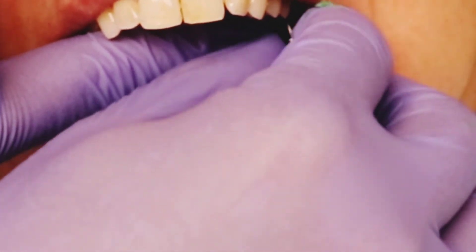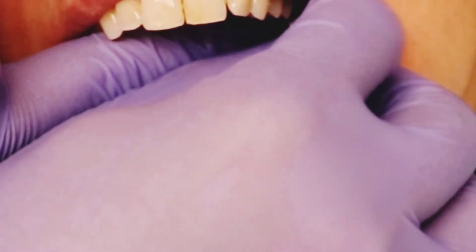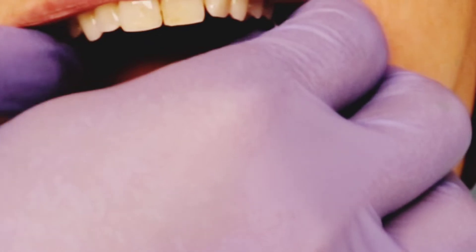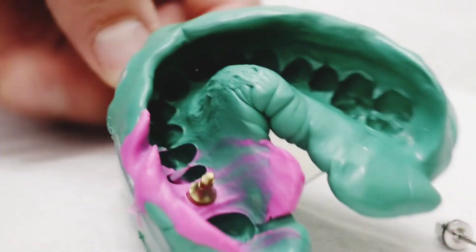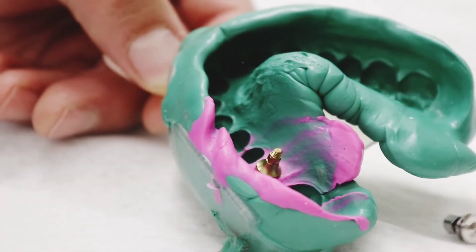We go ahead and replace the healing abutment and make sure it's nice and tight. I like to torque these in place because sometimes with the patient's tongue they'll loosen back up, which is a pain when they come back to your office — it wastes chair time and the patient doesn't want to be there.